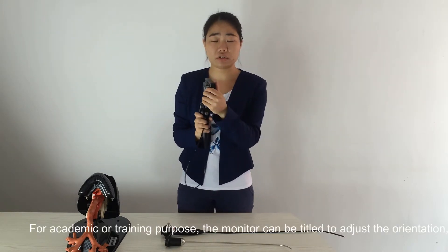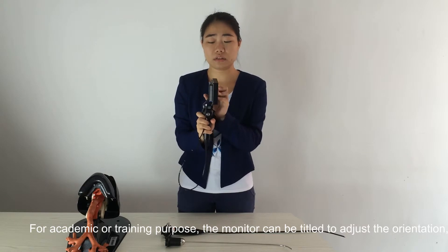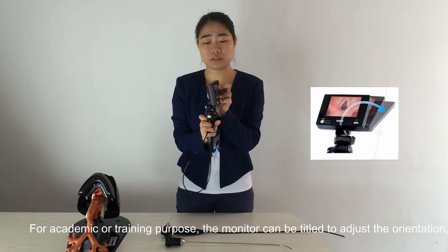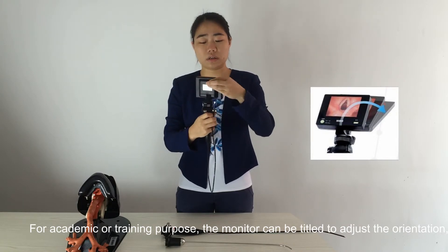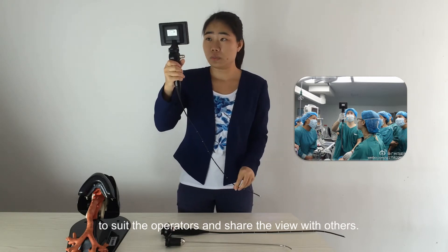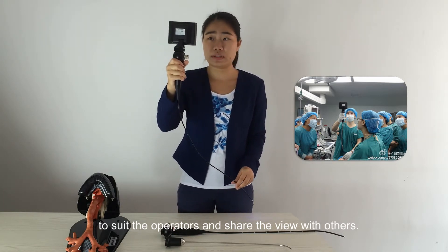For academic or training purposes, the monitor can be tilted to adjust its orientation to suit the operators and share the view with others.